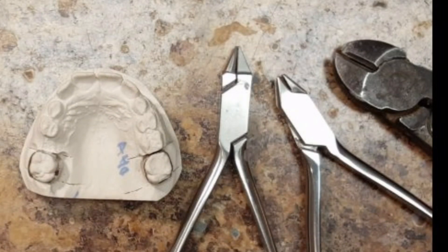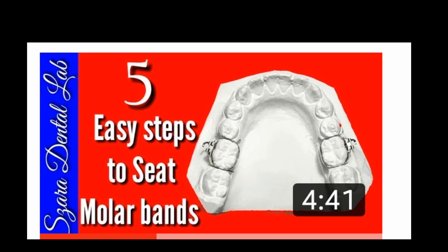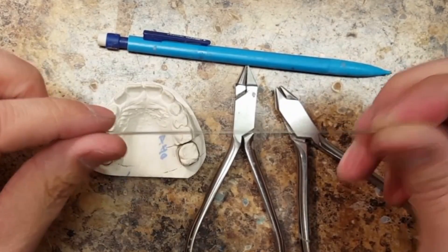These are the tools that I use to create the Nance button, and as you can see in this picture, I've seated bands. Follow the card above — that'll show you how I seat molar bands to create this appliance. Let's begin.